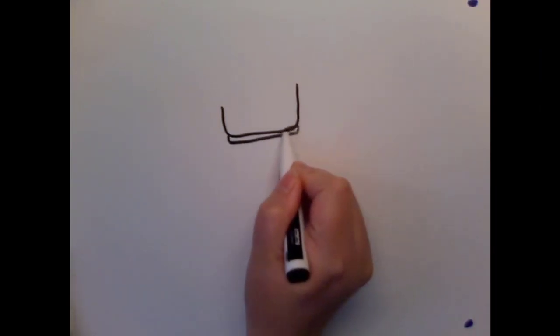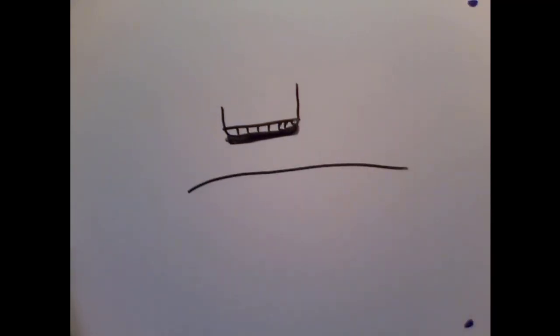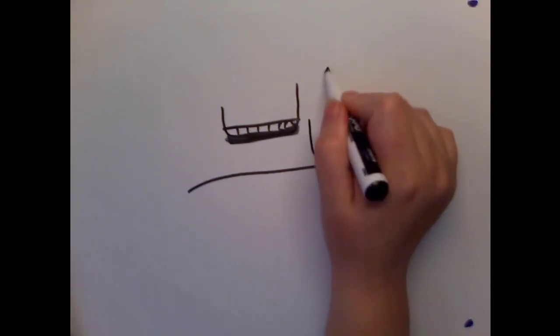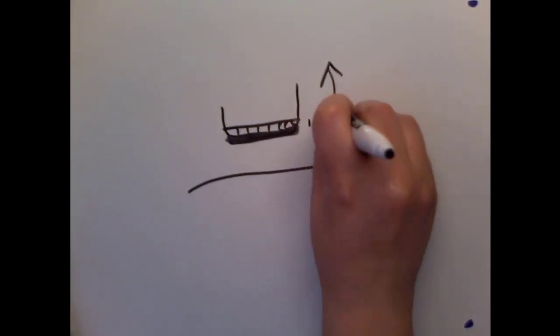So if we think about it, we have our transducer, and then we have our matching layer right at the face of the transducer. Our PZT crystals are back here. And then this is the skin that we are imaging on. If we just did PZT crystals to skin, most of that sound is going to get reflected back. Very little is going to go through. And because of that, we'll have lots of attenuation. We won't get our diagnostic images.